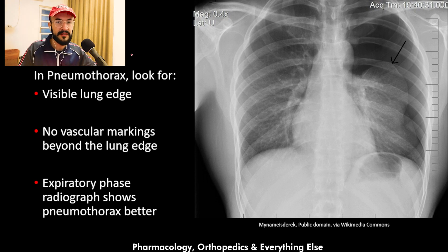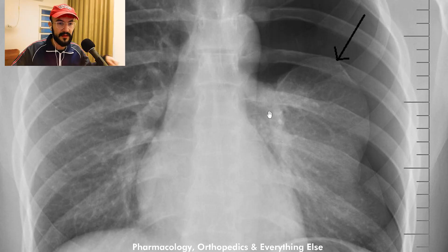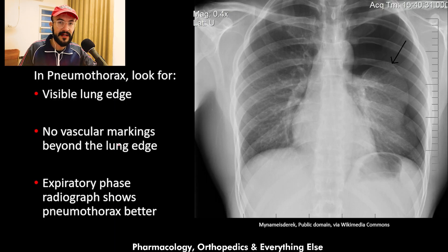When searching for a pneumothorax on a chest x-ray, start by looking over the lung fields for that lung edge. There is a left pneumothorax in this x-ray, and this is the lung edge you can see here. Basically the air is coming from outside, pushing the lung inward, and this is the lung edge as shown in a zoomed-in picture.